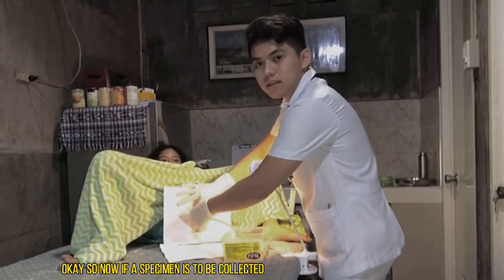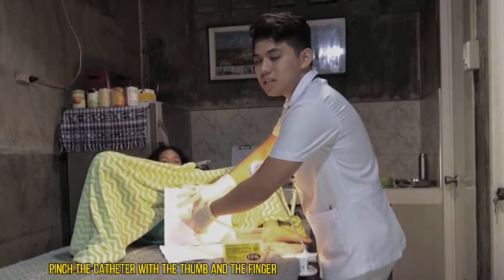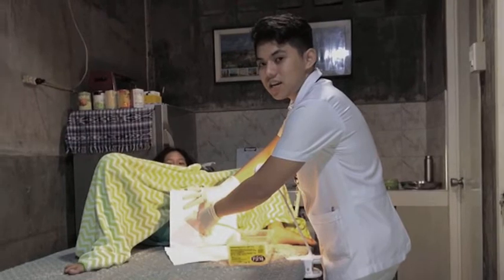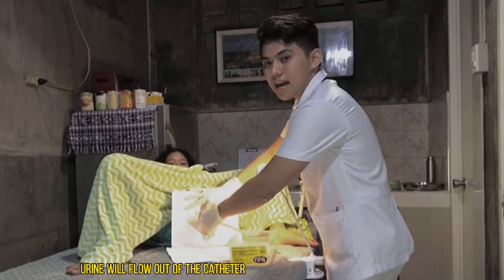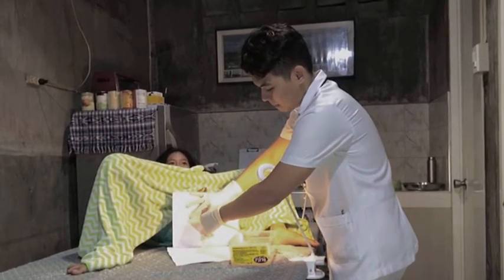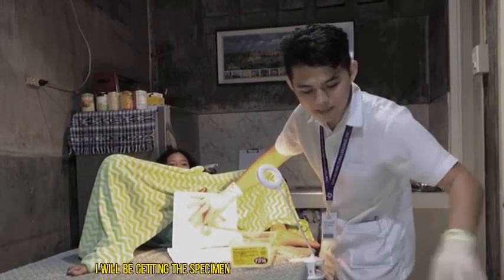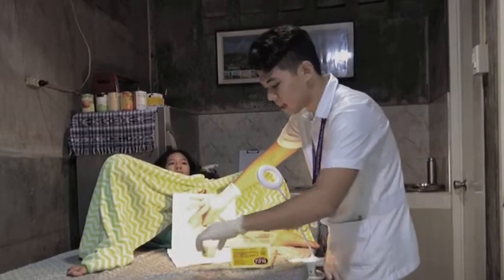Okay. So now, if a specimen is to be collected, pinch the catheter with the thumb and the finger while placing the specimen container in position, because urine will flow out the catheter if the lumen is not occluded. Since my dominant hand is sterile, I will be getting the specimen container, which is also sterile.